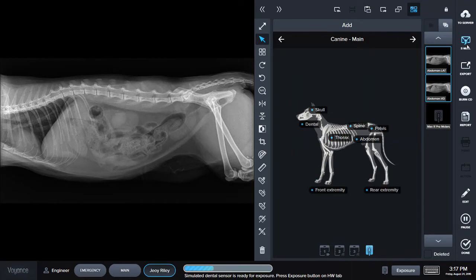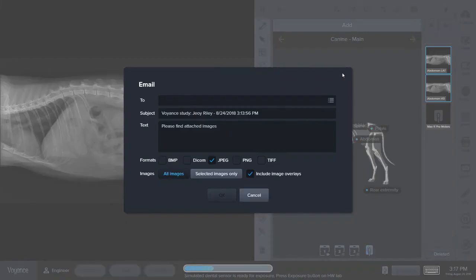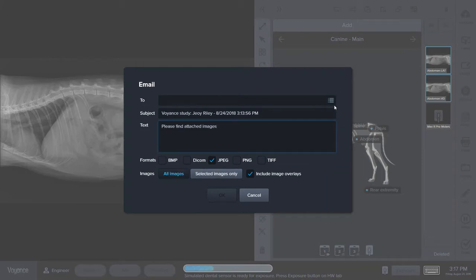To email, you add any text and you have five formats you can send. You can send one format or all of them. You can do selected images or all images. Here you can create an address book and add any frequent email addresses you'd like to send to.